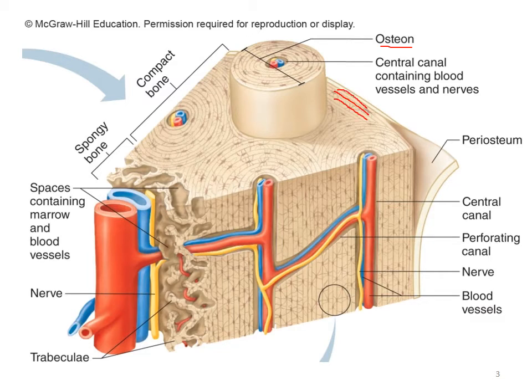They are around the outside of the bone in order to give it its shape. And on our model, these are the ones that are raised up. You'll see it in a second. I'll point it out. They look like three little billboards. Because it's hard to label these individual little layers that are in here, if I had a picture, I'd probably be pointing to the lamella on there, and so those big billboard lamella on there. So just wanted to point that out.